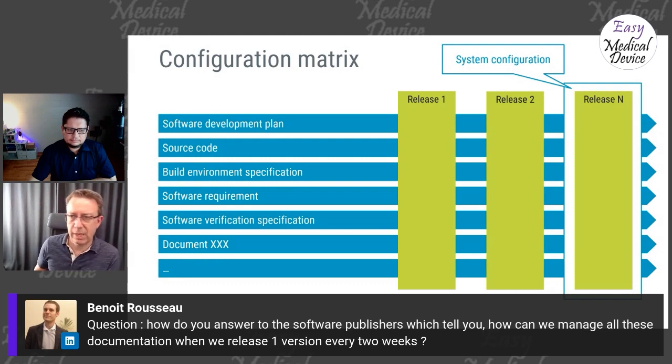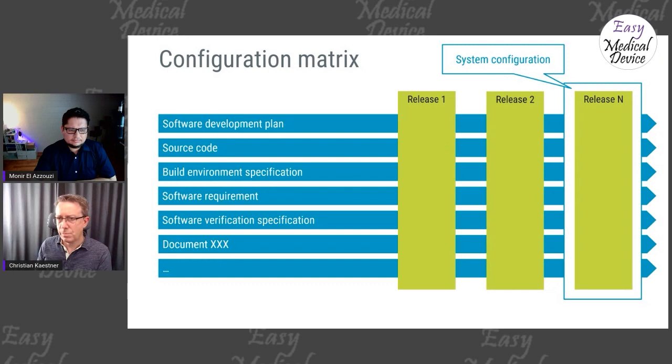Yeah, I think that's related to that one. So speaking of documents, how can that be done? I think if you have this configuration matrix in mind, so you have the list of documents, you don't need to update all documents. By no means, absolutely not.